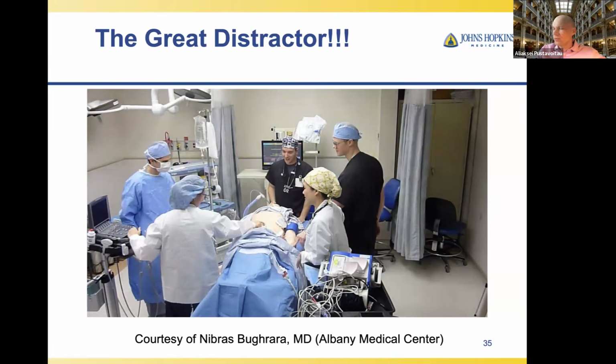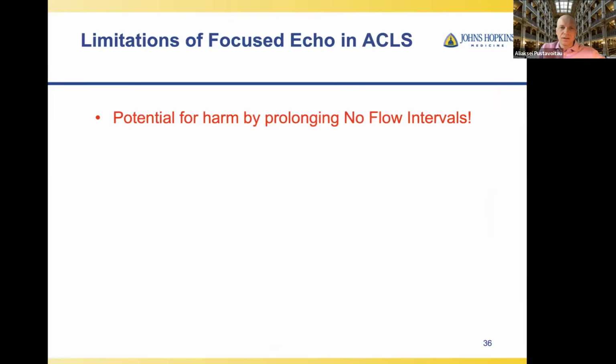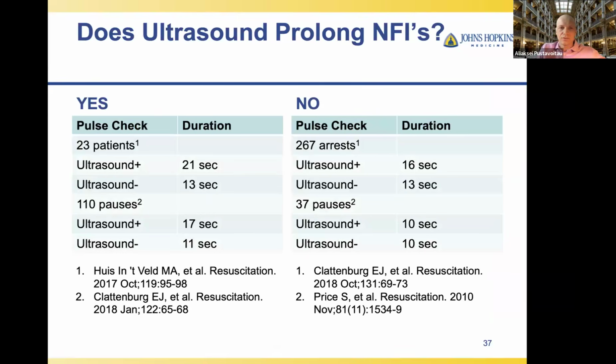So you see, all of a sudden, instead of actually paying attention to the patient, the whole team starts looking, oh, I've got an echo, right? I'm gonna start looking at the screen. I see the heart. Oh, let's talk about it, right? And they're forgetting that the main thing they have to be doing is actually chest compression. So there is potential for harm by prolonging no-flow intervals because it can be very distracting, and that's why those skills have to be trained, right?